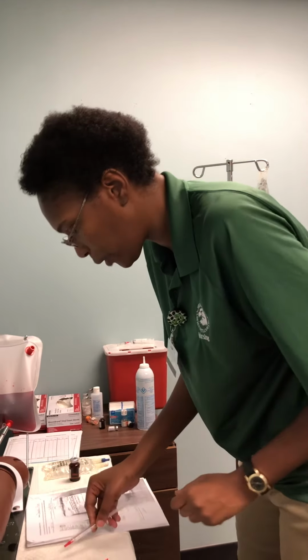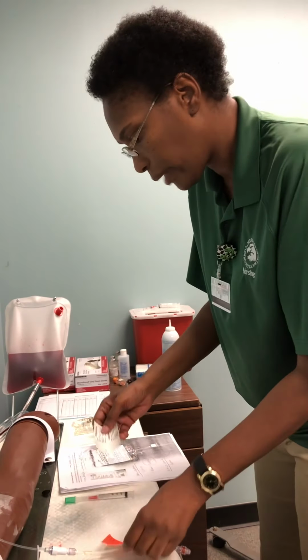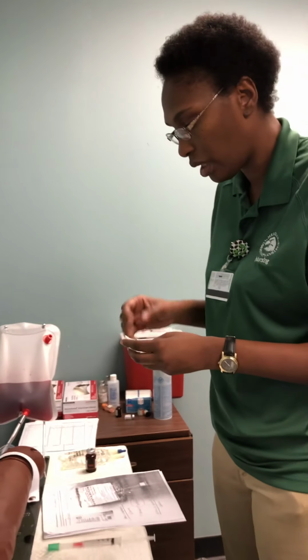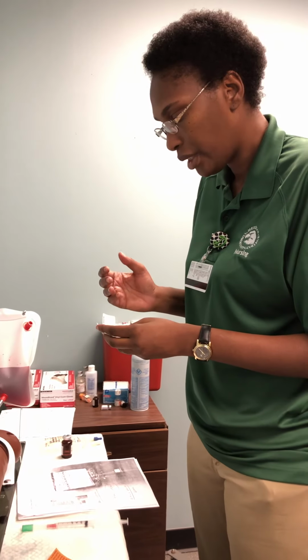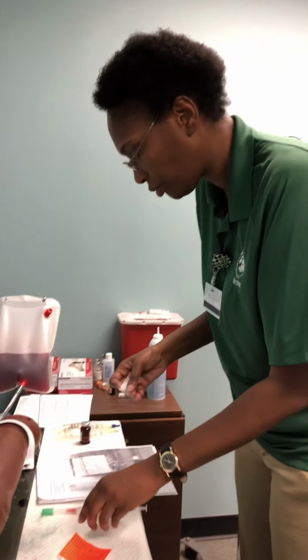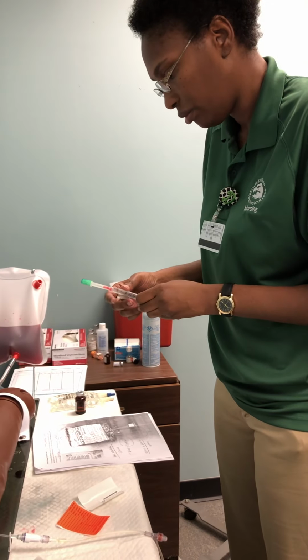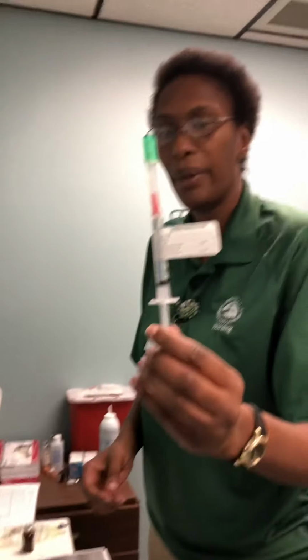Making sure there's no air bubbles in the syringe. Then I will label my furosemide with the patient's name, the medication, the amount, the prepared date and time, my initials, the expiration date and time. Three mLs of Lasix.